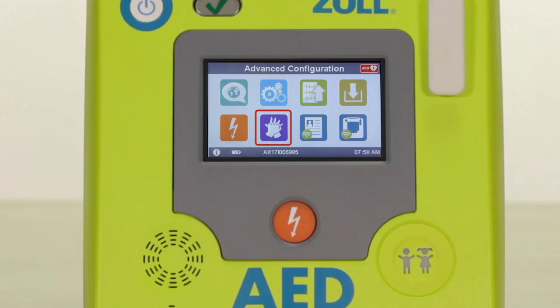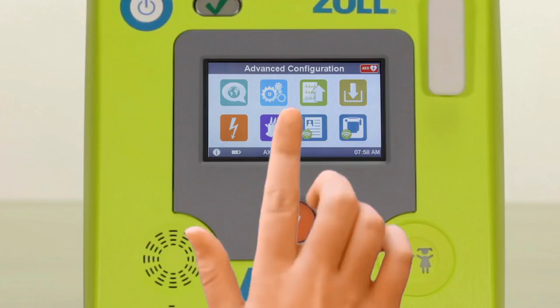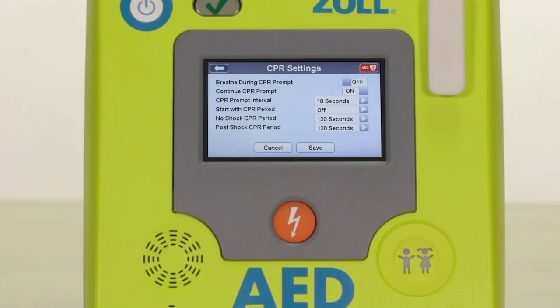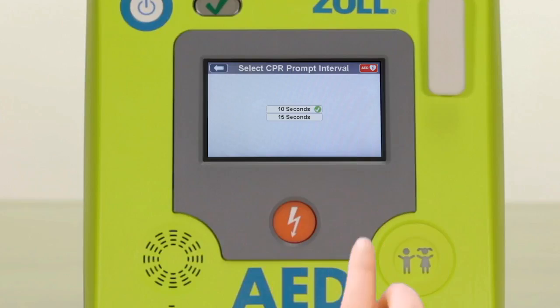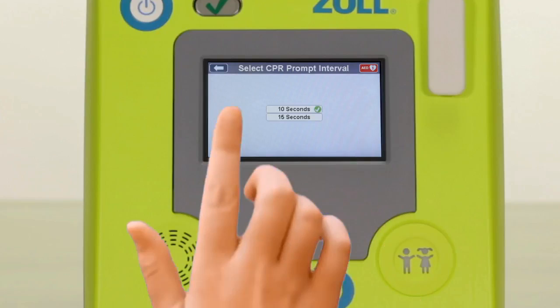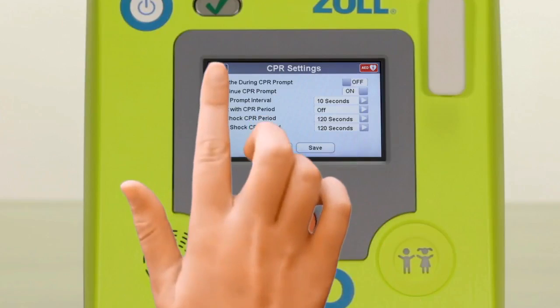The purple overlapping hands icon allows you to modify the CPR prompting and intervals based on your particular preferences and protocols. Factory default settings are based on the most current guideline recommendations and should be left in place for the majority of users. If you do prefer to change the setting, select the item you wish to modify by touching the respective option on the screen, choosing the prompt or interval setting you prefer, and then select save.